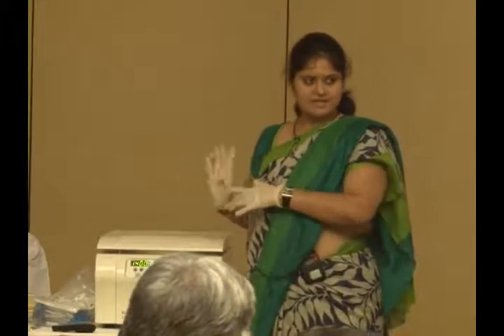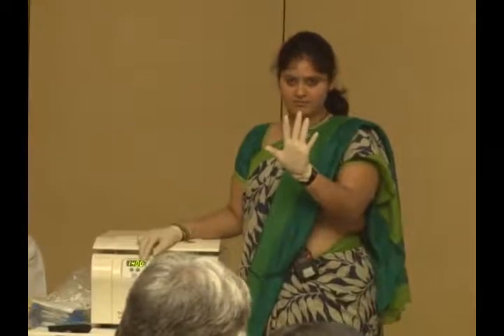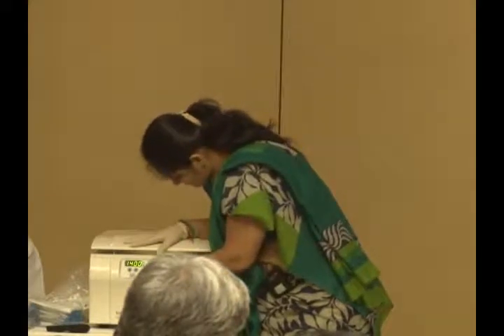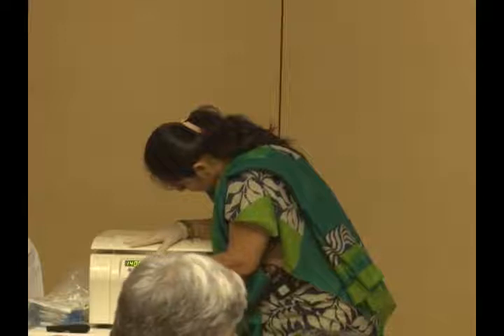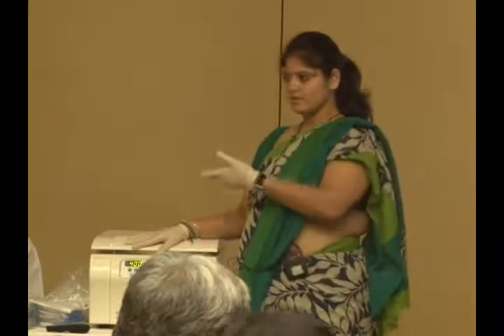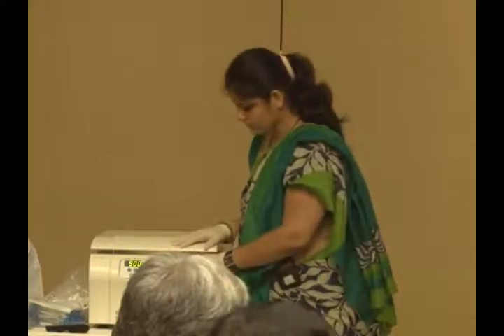Shall I start the centrifuge? Now I will not put it for 20 minutes because we don't have time. We just assume that 20 minutes get over. Right now I am putting it at 10 minutes. Now I can give tubes to everybody and they can practice if they want. No? Okay.